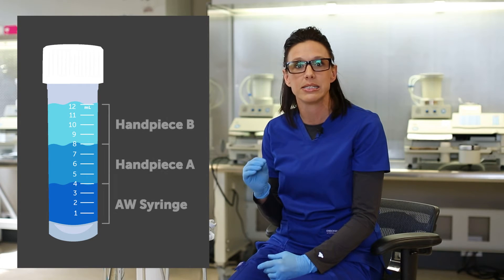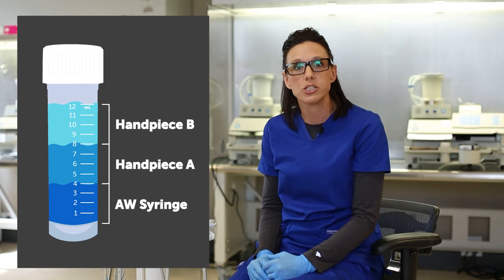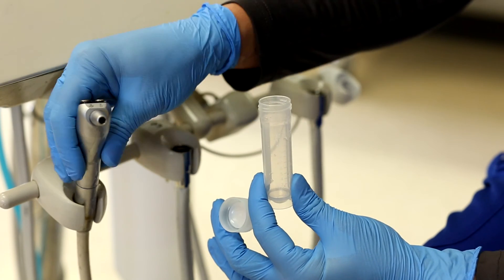With three water lines, we want each water line to contribute the same amount of water, so one-third of the sample vial will be filled from each water line. Even if you have four or five, just make sure that each water line contributes the same amount of water to fill the vial.